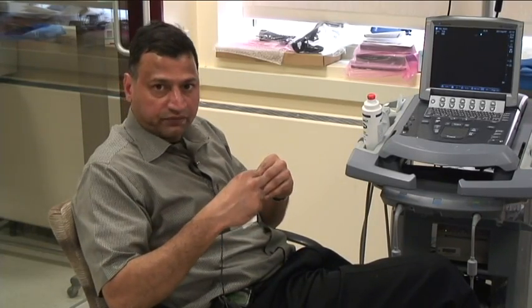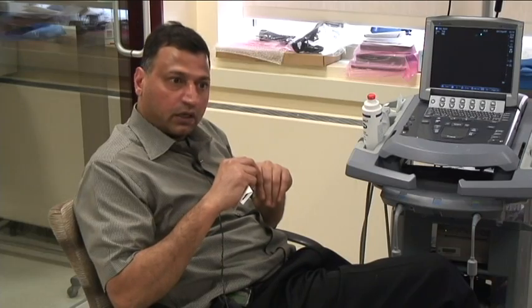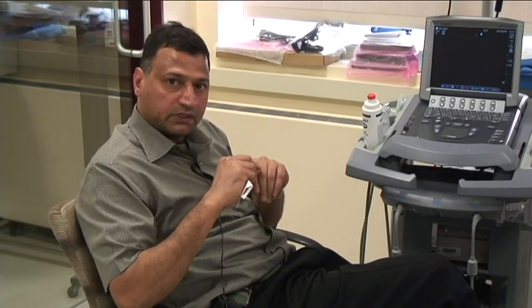And again, in mechanically ventilated patients, sometimes this is complicated when the patient is making inspiratory efforts on top of the positive pressure ventilation. So all these have to be taken into consideration when we are using these parameters that we talked about.